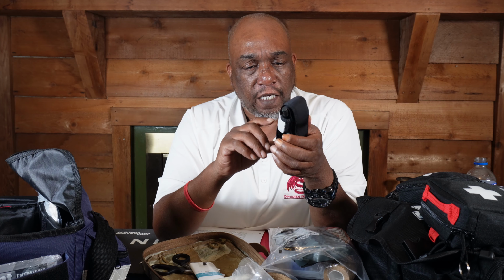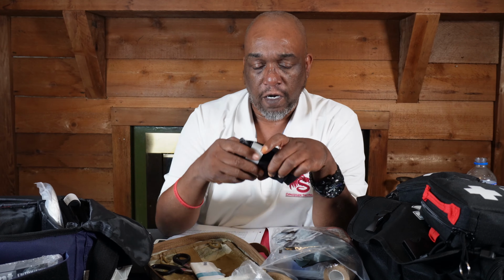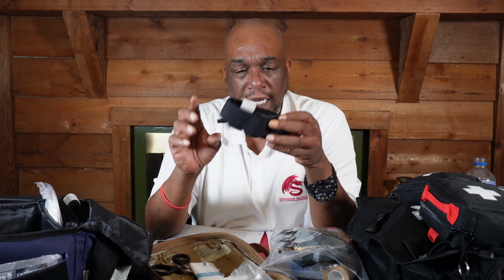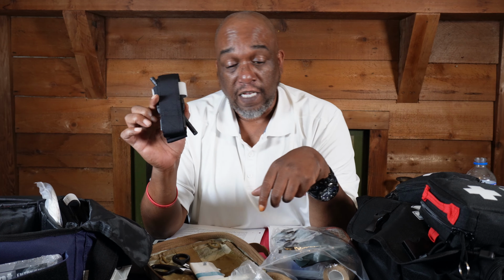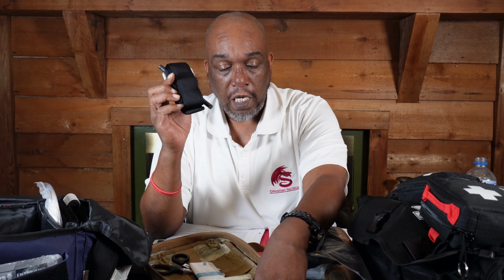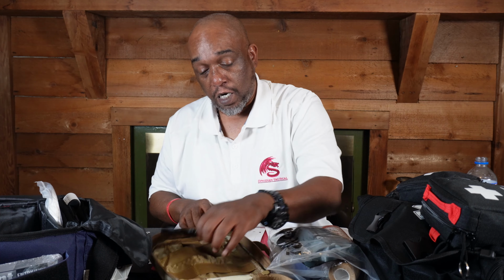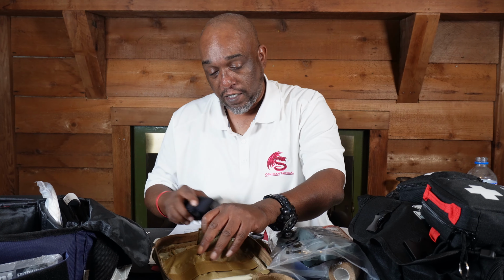I like to use a good CAT tourniquet. It's a couple of places. Be careful about these things on Amazon. Even with this one, I got this one here, but I got plenty of extra ones, so I'll probably use some of the better ones I have inside my kit. A lot of people will store these separately, just on the belt by itself. But make sure, if you're a firearms owner, one of the main things you want to have in your trauma kit is a tourniquet. This is first and foremost. Before you do anything else, get a tourniquet.